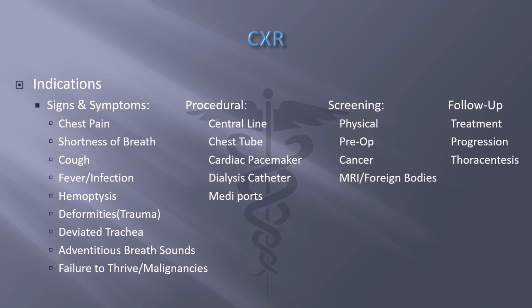Also, we will do x-rays after we do a procedure. We'll place central lines or chest tubes. The cardiologist will place a pacemaker. The PAs, such as myself, will even put in a dialysis catheter, and after I put in a dialysis catheter, I will do a chest x-ray.